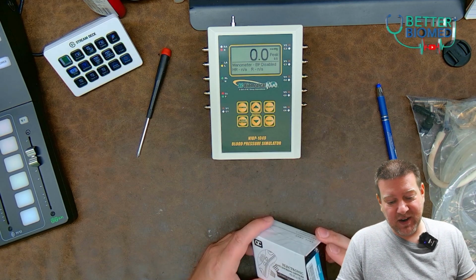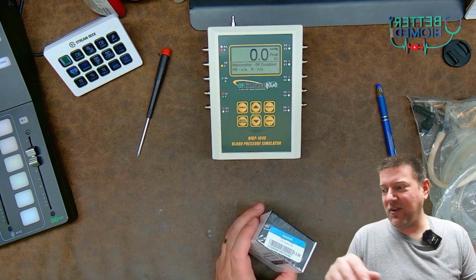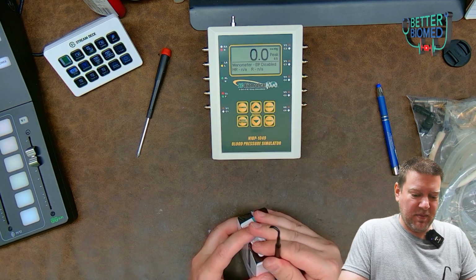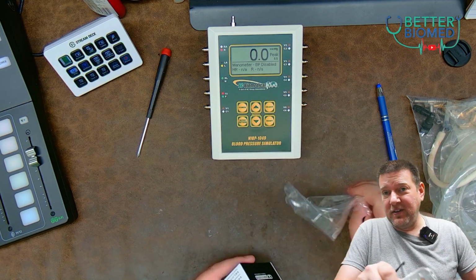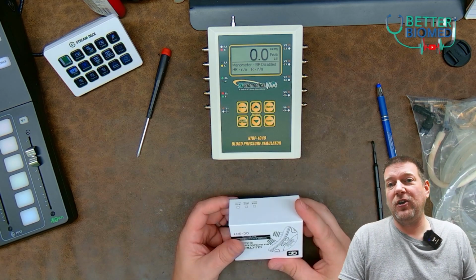And we are going to open it up. So you can see I paid $2.99 for this fine piece of medical technology right here. So a CPAP is a continuous positive airway pressure. And what it's used for is obstructive sleep apnea. Now, there's other types of sleep apnea, but obstructive sleep apnea is when your passages start to close up.